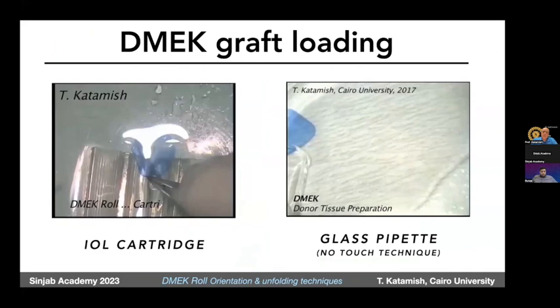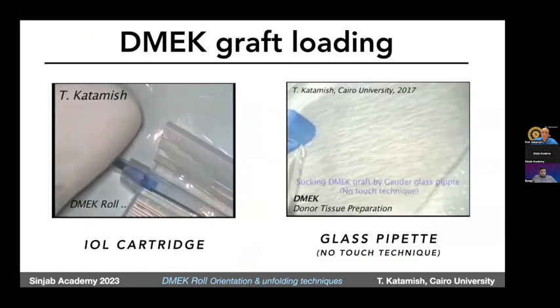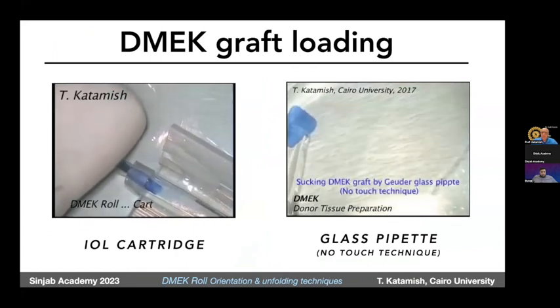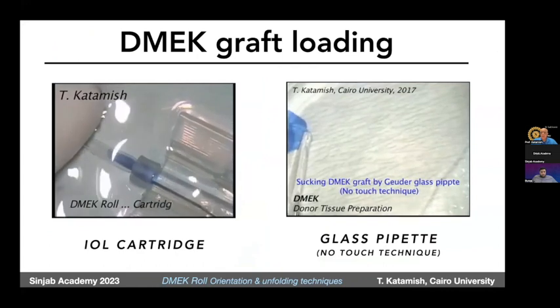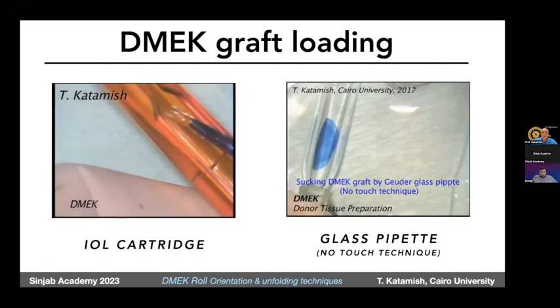So you want to have a carrier. This carrier, we call it the DMEK injectors. You either use an intraocular lens cartridge, or you may use the non-touch technique for loading the DMEK graft. And then you come to the patient.